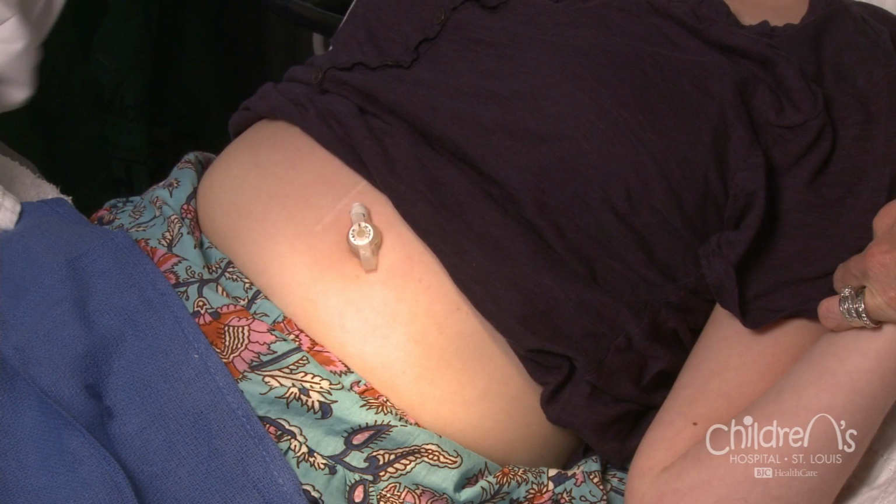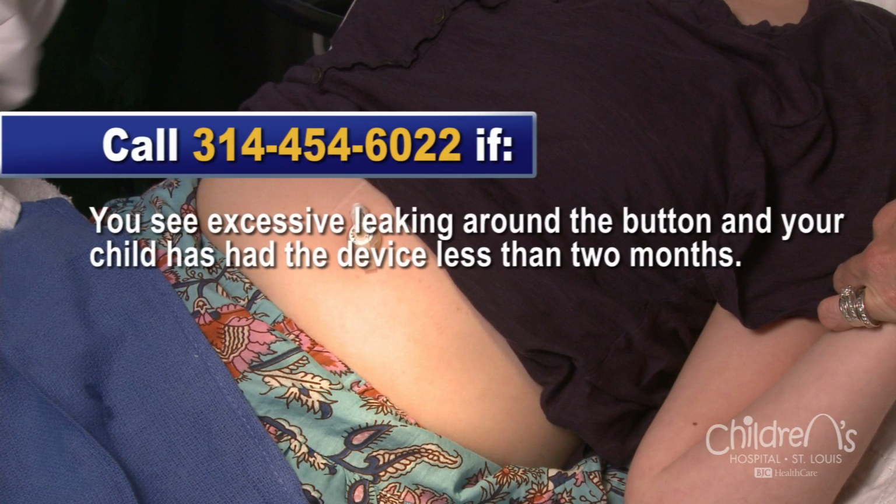If you notice excessive leaking around your child's button and your child has had the device for less than 2 months, please call the surgery office for instructions. If leaking comes from the valve, then the button has malfunctioned. Keep the button plugged to prevent leaking of fluid into your child's skin. Then call the surgery office.